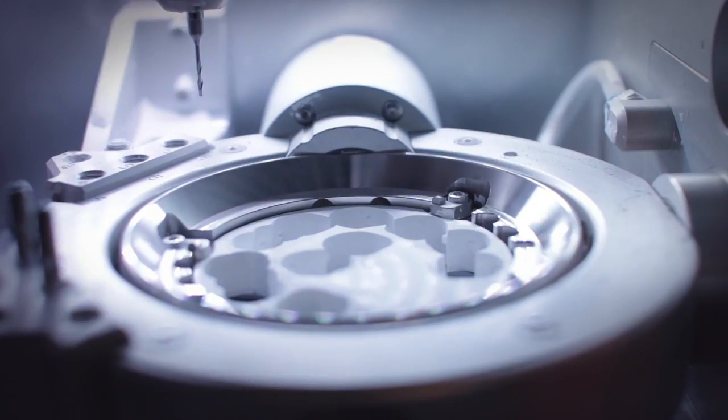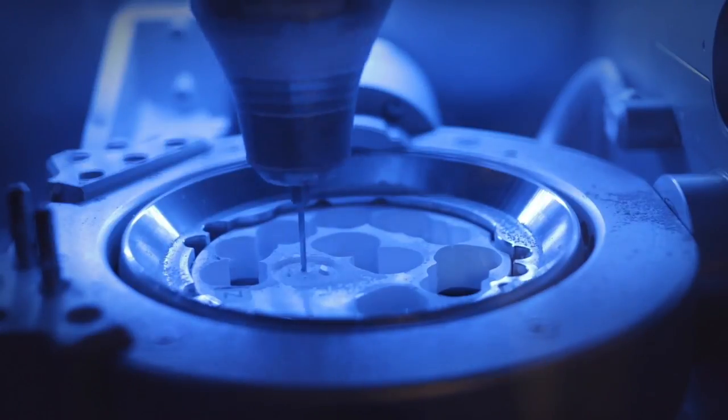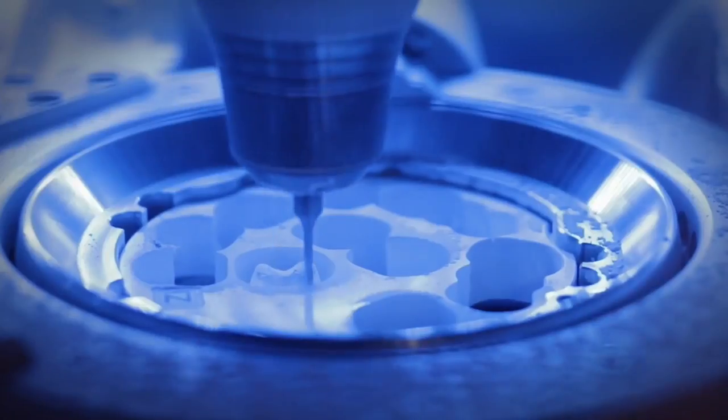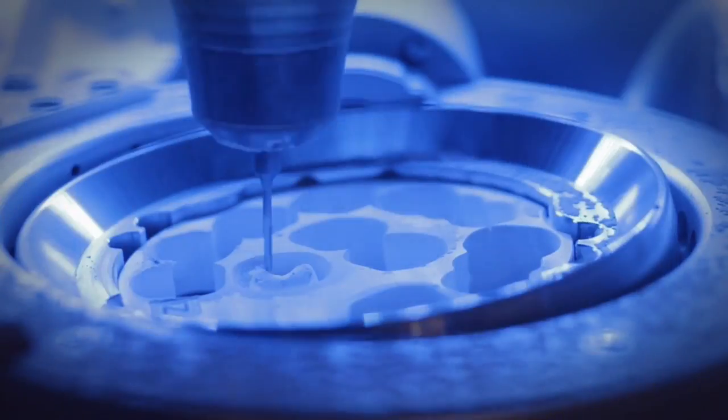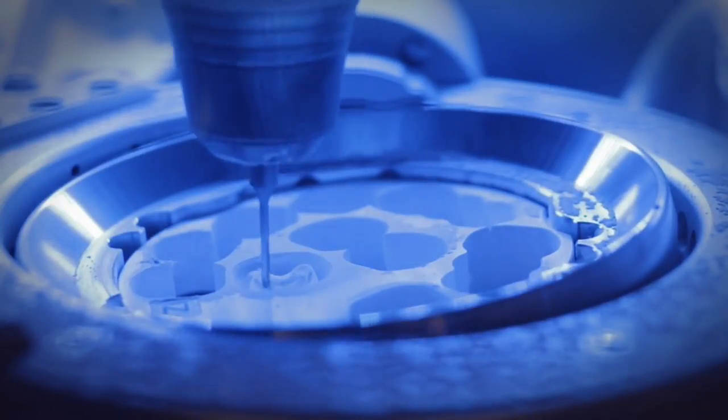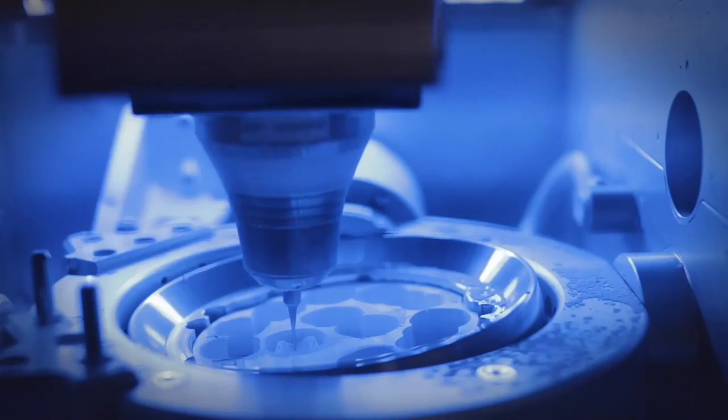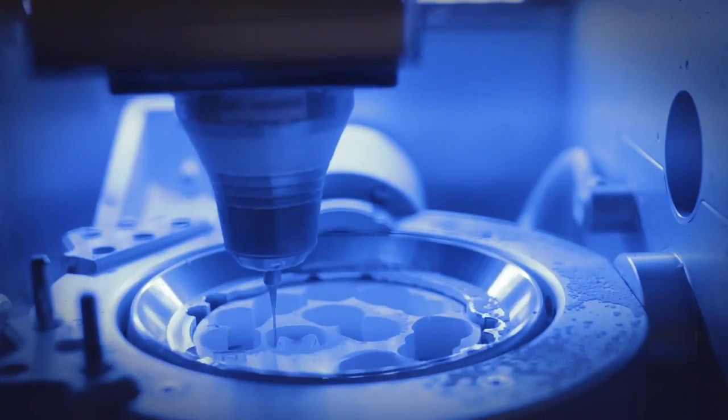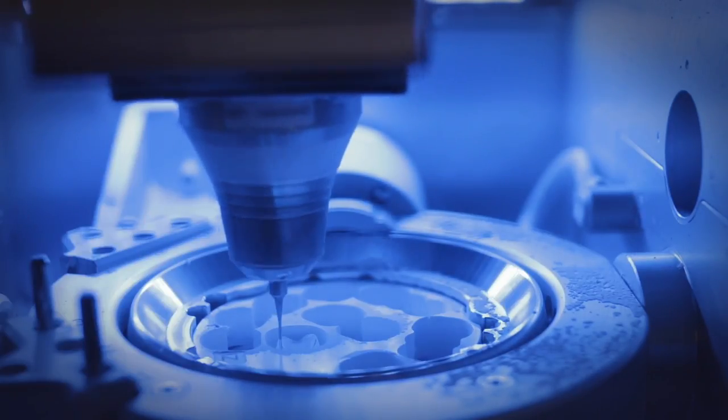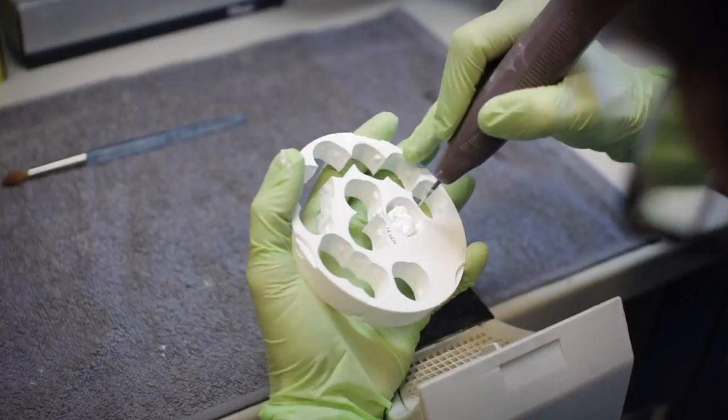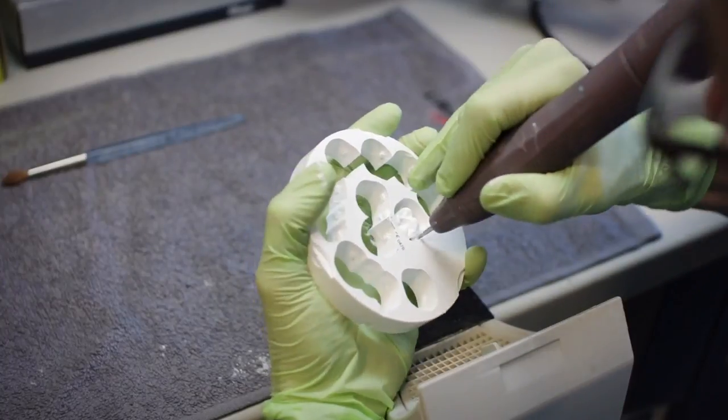The material we're using for this demonstration is zirconia with the patel. When sintered, this material shrinks 20%. The crown is carefully removed from the block.